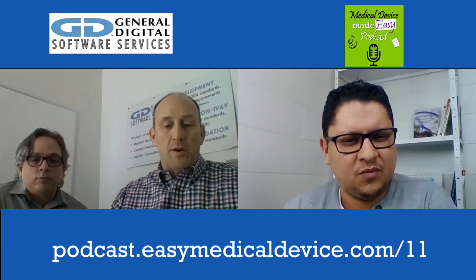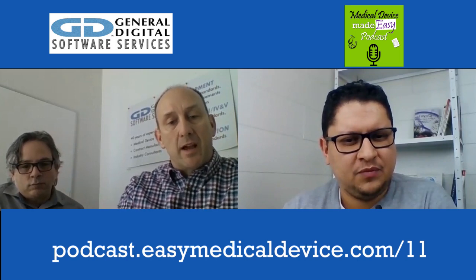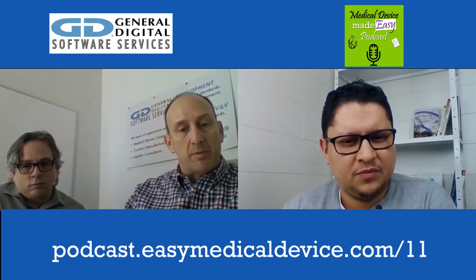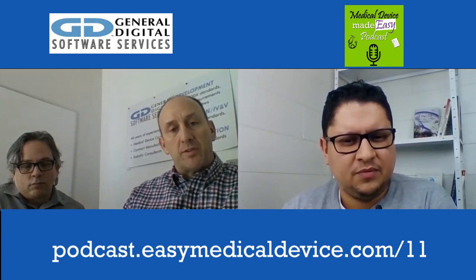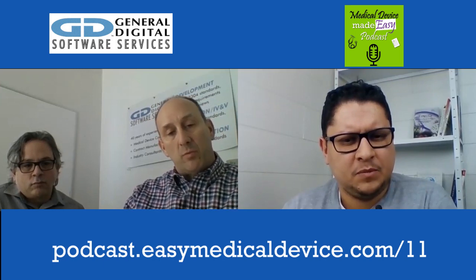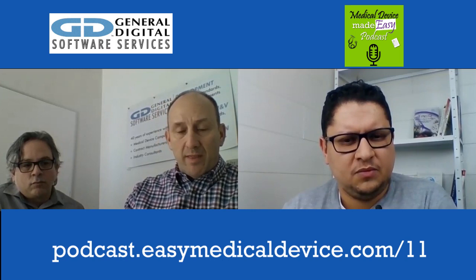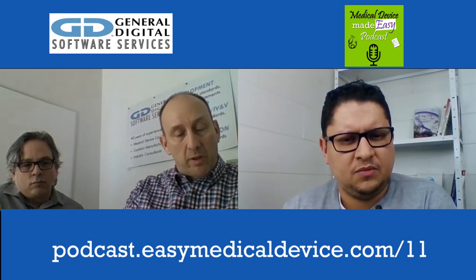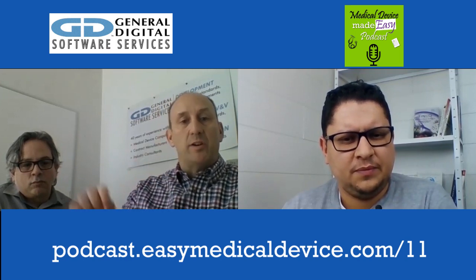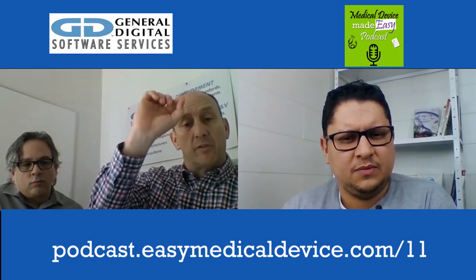Yeah. So when you're doing this process and you start with the intended use, it's very systematic in how it becomes more granular as you come out. You break it out in more detail each step as you go. As Rafael was saying, we have the high level requirements, and then you also have low level requirements that we can use to test each unit of code and each module. At that point, that will trace up to the low level requirements, and from there we'll trace up again to the architecture, and trace up again to the system design, and trace up again to the high level requirements.